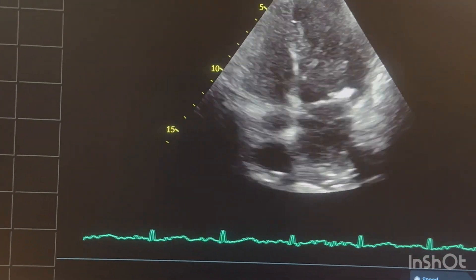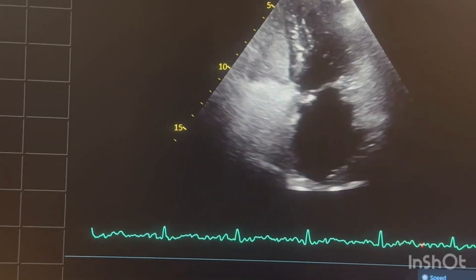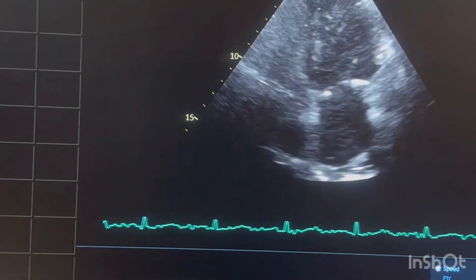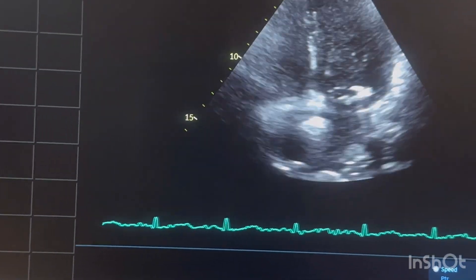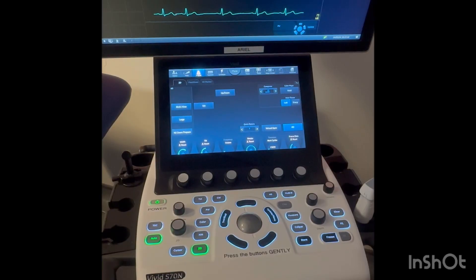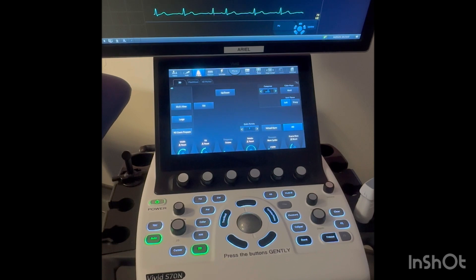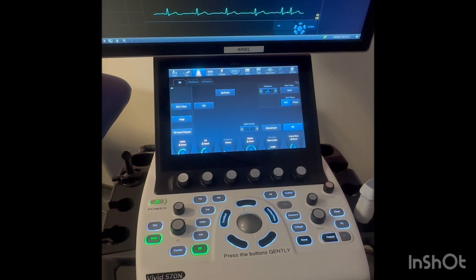So this is how you should perform a bubble study — get one or two beats before the bubble arrives, and once the bubbles enter the left heart, leave some additional beats as well. I realize I almost forgot the most important aspect of this video: how to properly acquire the images. If you don't acquire the image properly, all the effort is lost because nobody will be able to tell whether the bubbles came in at four beats or six beats.